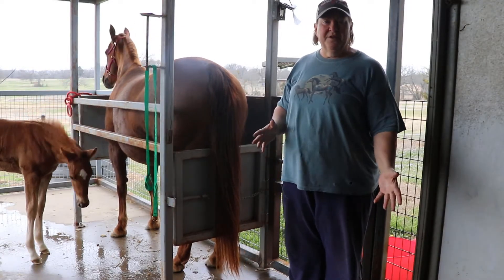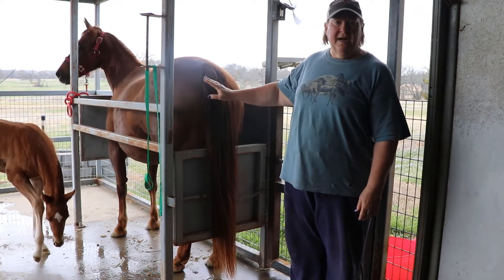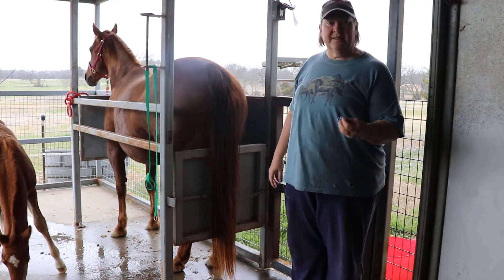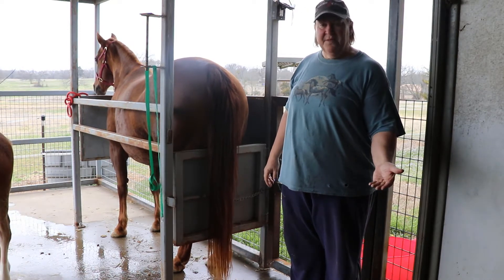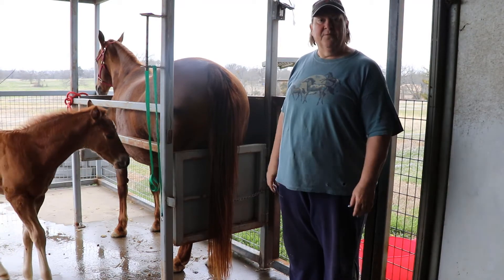What we're getting prepared to do today is to breed this mare. She foaled about three weeks ago, went through her full heat, and we've short-cycled her. She's sitting now this morning on a 36mm soft follicle. So we've picked up the semen, we're going to get her cleaned up, and hopefully make a baby.